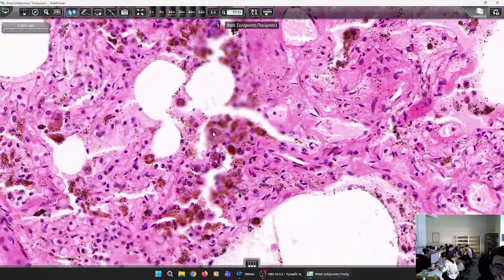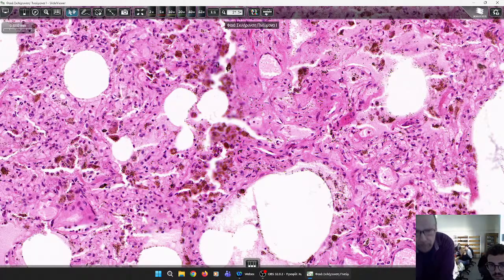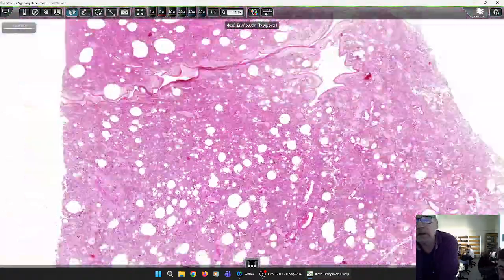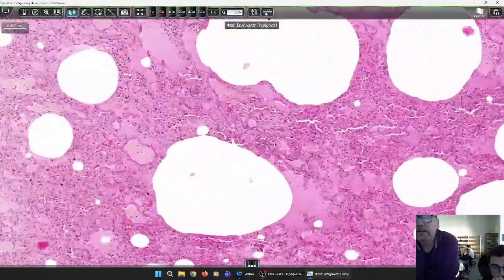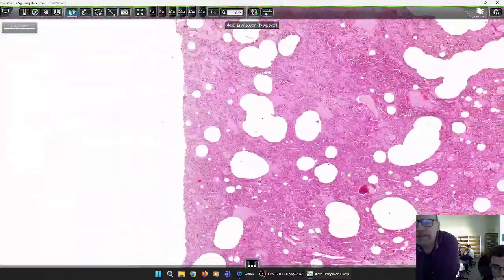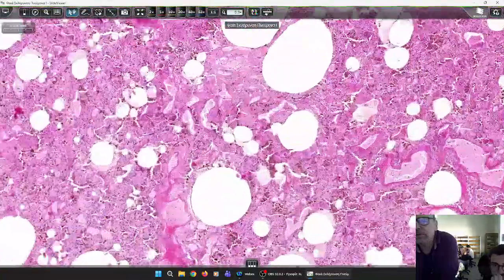If this situation persists, the lung will become sclerotic. It will become fibrous. However, I do not think that this is the case here, because I can see the hemosiderin pigment deposition in the macrophage. However, I'm not sure that I see sclerosis. This is still an acute condition.